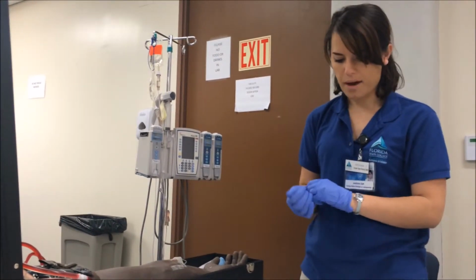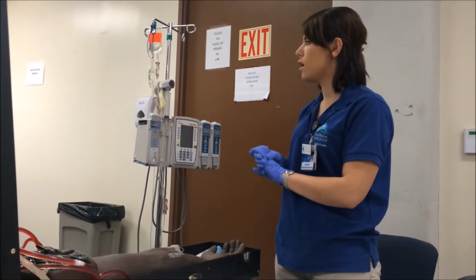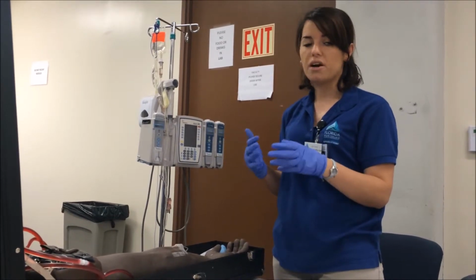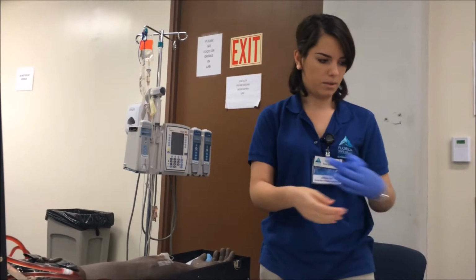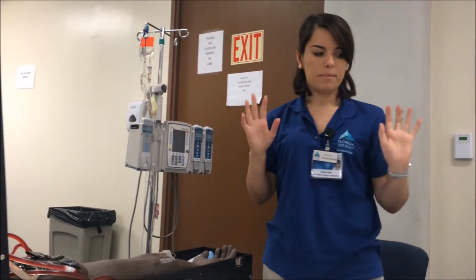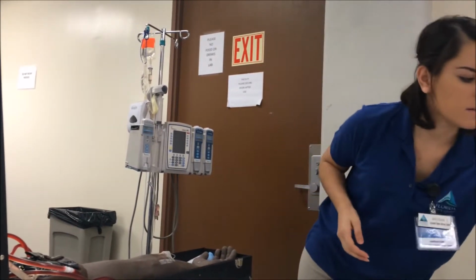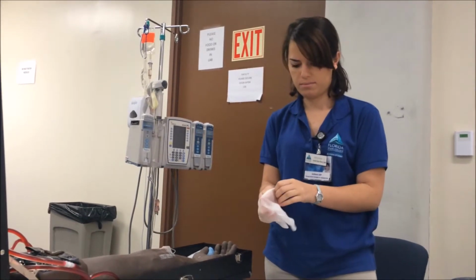Okay, so at this time, I will make sure to let that run, and I will also continue to look on it periodically. And once my medication is done, I'll go ahead and remove my gloves real quick. Alright, so I'm gonna throw that in the trash. Once my medication is done, I'll go right back into my patient's room, make sure I wash my hands, and apply new gloves on.